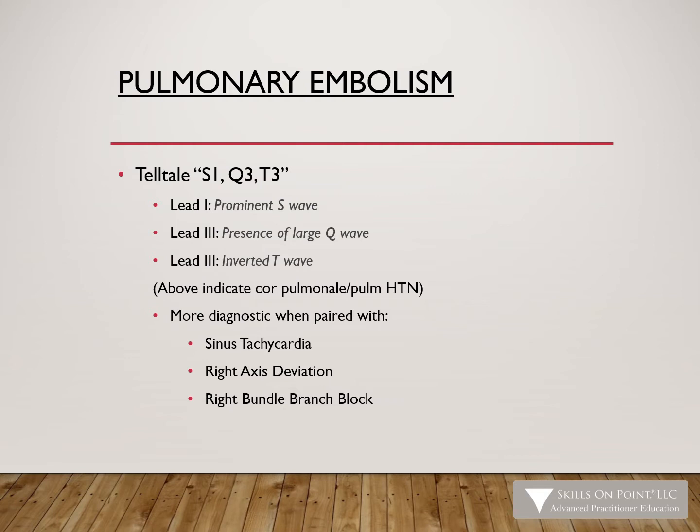So that would be a reason for us to say all of a sudden we have an acute elevation in the pressure in the right ventricle. And what's that going to look like? Well, it's going to mean that all of a sudden we're going to swing our normal axis towards the right because we're going to have a whole bunch of engorgement of the RV that's going to electrically have a time and a place. It's also going to have a presence of a Q wave and that T wave in lead 3, and it's going to show us basically where we have extra pressure going on, and it's causing some stress on the heart. So you put together all of that picture, that gives you what you need to diagnose that, and here you go.